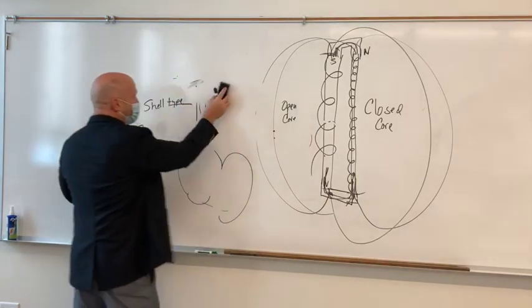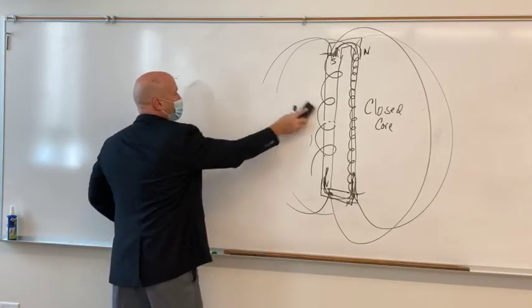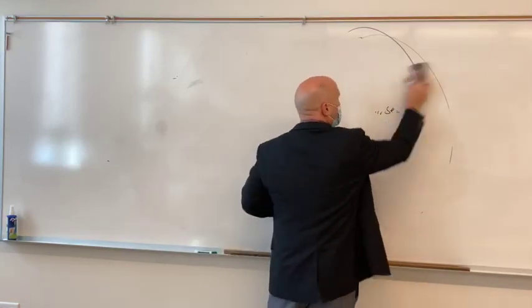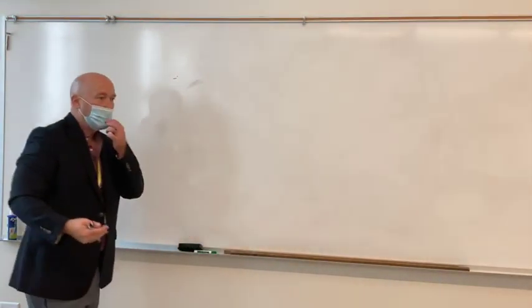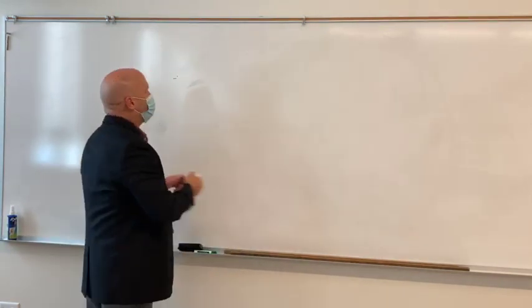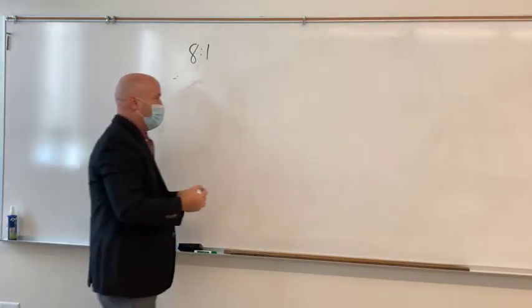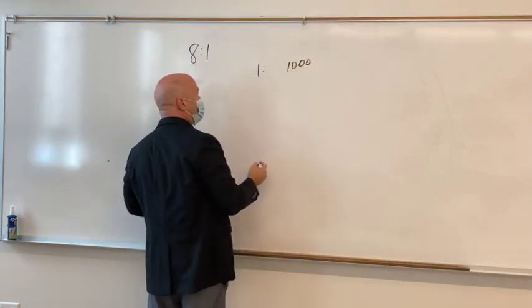Okay, so how do they work? Well, there is mathematics to it, and that is according to the transformer law. All of our transformers work according to the transformer law, and transformer law says two things. The change in voltage between the primary side and the secondary side is directly proportional to the change in turns ratio. In a step-up transformer, what you may have is 1 to 1,000.